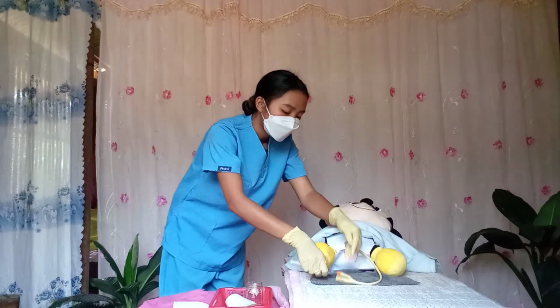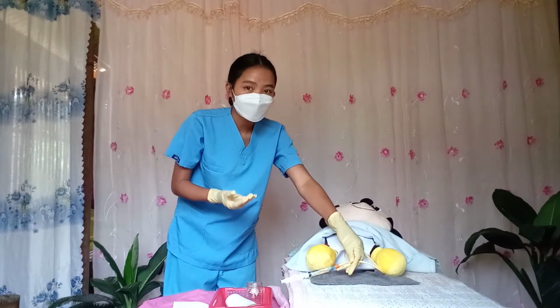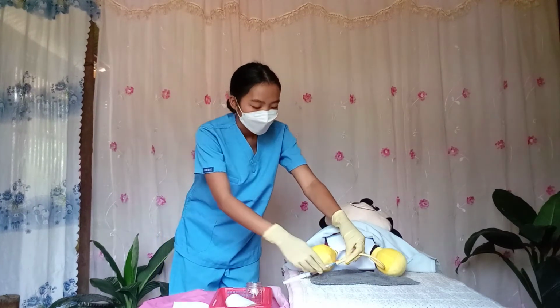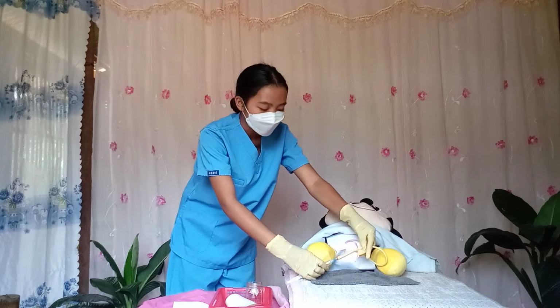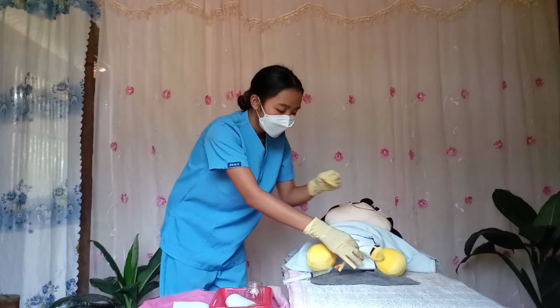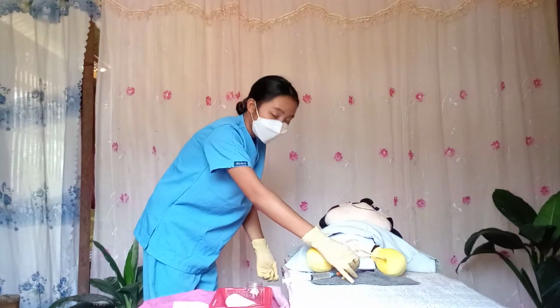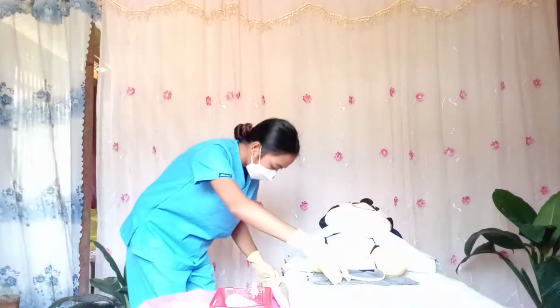And then after that, rest beside the patient's pubis while holding the catheter to avoid pushing and pulling of the catheter. Then the next thing that we're going to do is connect my catheter to the urine bag.